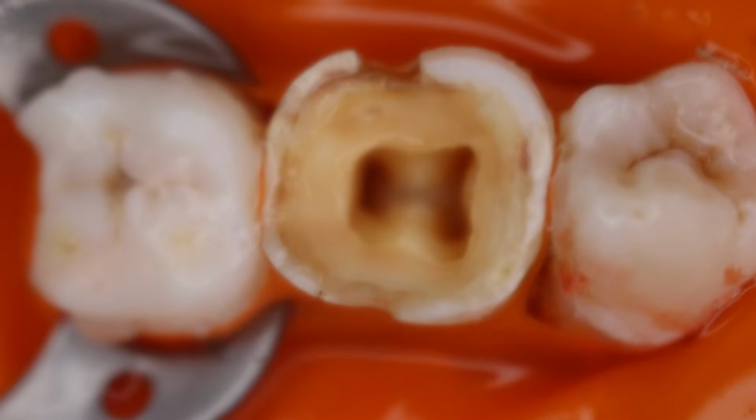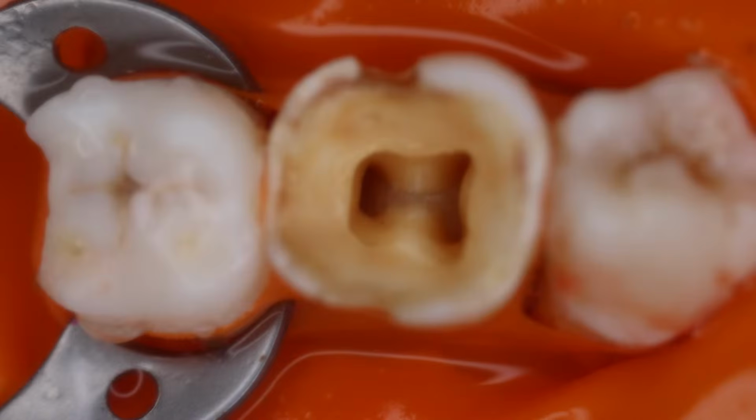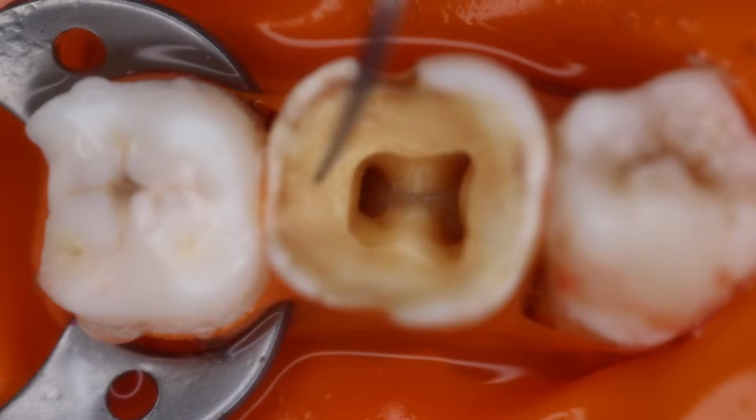So as you can see, we have removed the caries and we are able to easily find the canal orifices. You can clearly see the canal orifices when we have removed all the caries. We are trying to maintain the healthy tooth structure in and around.